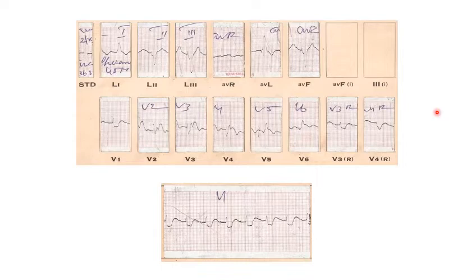Sir, each QRS complex is preceded by P waves as seen in the lead V1. And sir, PR interval seems to be normal. Okay. There is a rhythm strip. You should look at the rhythm strip also. Lower there is a rhythm strip. Yes, sir. Lower rhythm strip is seen, sir. Sir, the PR interval is normal, sir. Okay, very good. And sir, in the terminal part of the QRS in V1, some notching is there.